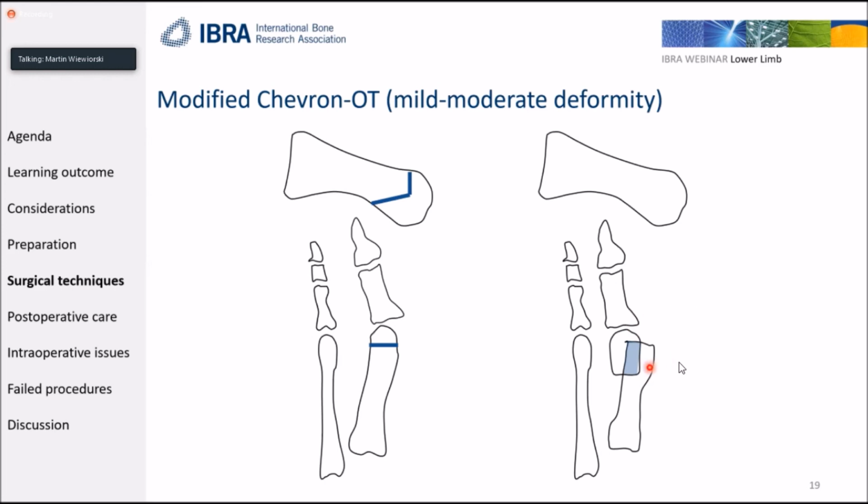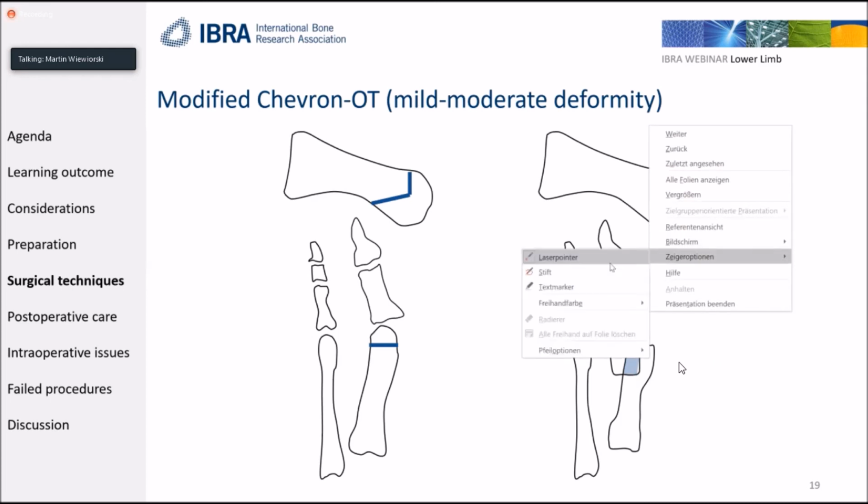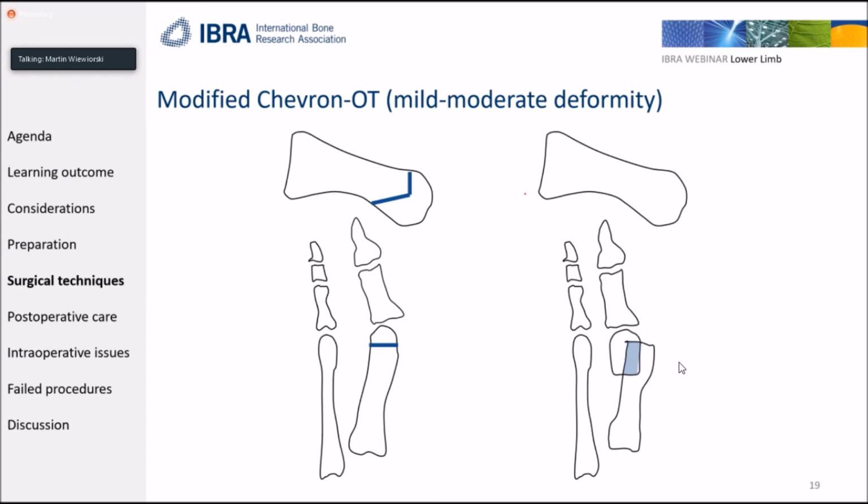But so what I draw here in blue is basically your contact area of those fragments, right? So this is not much contact area. So basically, how do you fix this? I would fix this, or for example, Victor in Basel is fixing this with these CCS compression screws I was talking about, size 2.2. Basically, you can put 2 of the screws here in the head, not bicortical. Those screws, they sink here in the bone.